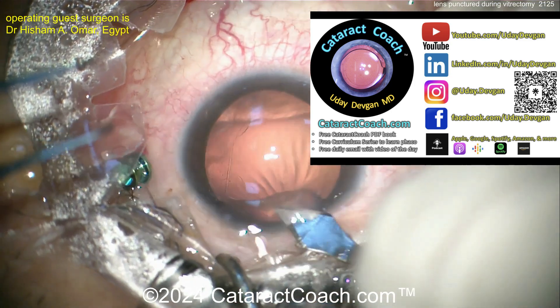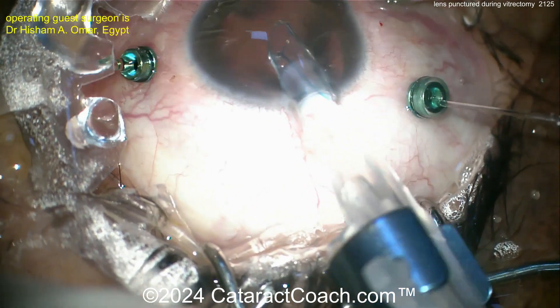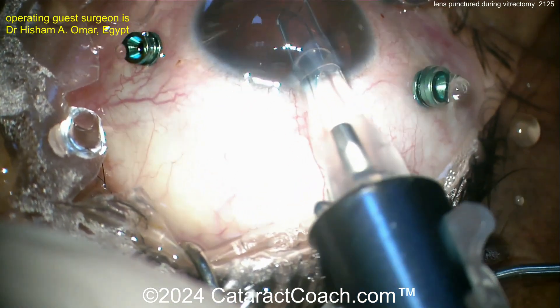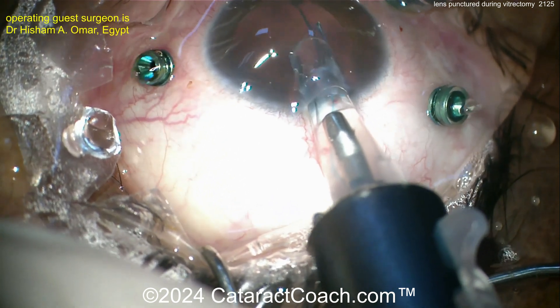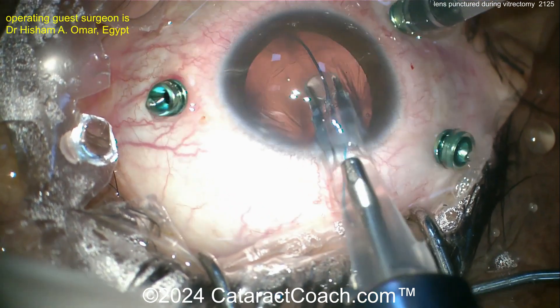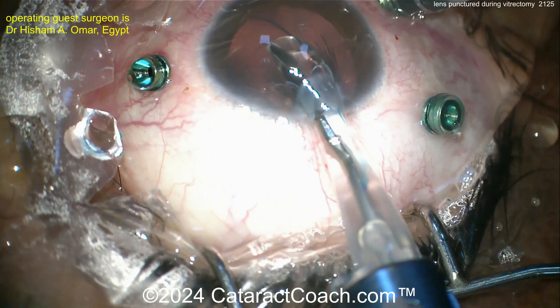Now there's the incision for the eye. There's the three-piece lens — remember the 7L rule: the first haptic should look like the number seven, and the trailing haptic like the letter L. There's the seven coming in — beautiful. Getting that into the sulcus nicely done. Now the optic comes out — placed very nicely, gently, appropriately. Beautiful.